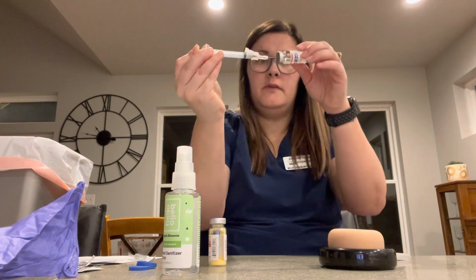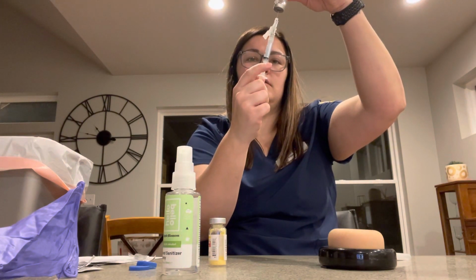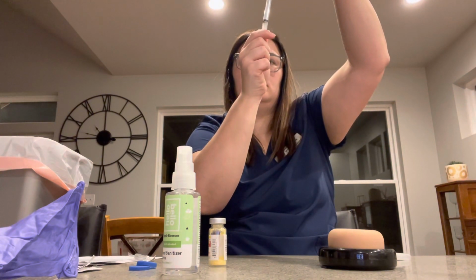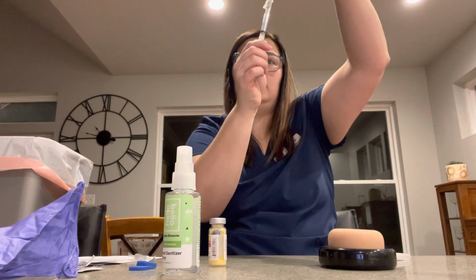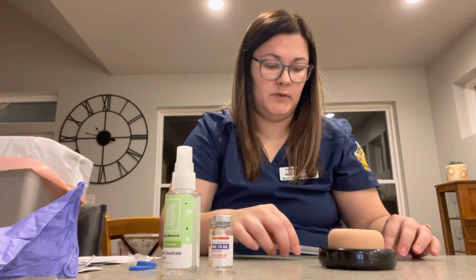We'll then invert the vial and withdraw 2.8 milliliters of the diluent. Then making sure there is no air in there, I will withdraw that and recap.